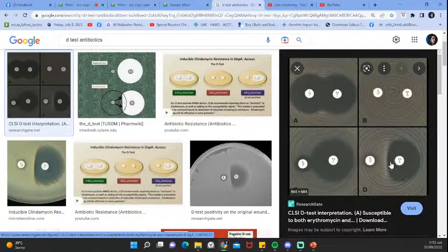Okay? So can I do it? Do I have to do it on a separate agar? No. You can do it on the same agar or the same plate. Okay? Just make sure that these two antibiotics are placed together. Okay? Clear ba yon? So report ko nito, both are susceptible. Both are resistant. One erythromycin sensitive. Erythromycin resistant, and then this one is clindamycin susceptible. This one, clindamycin resistant, erythromycin resistant. Ganun yung pag-report. Okay ba?